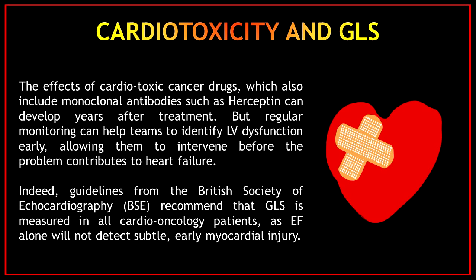Indeed, guidelines from the British Society of Echocardiography recommend that global longitudinal strain is measured in all cardio-oncology patients, as ejection fraction alone will not detect subtle early myocardial injury.